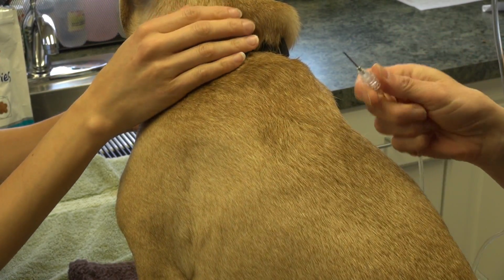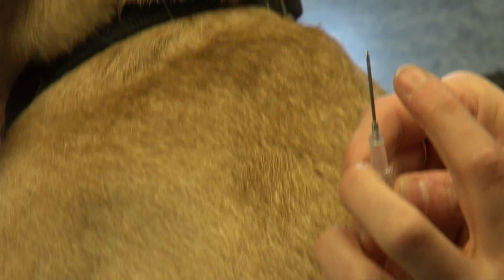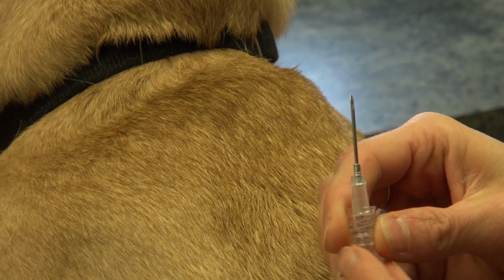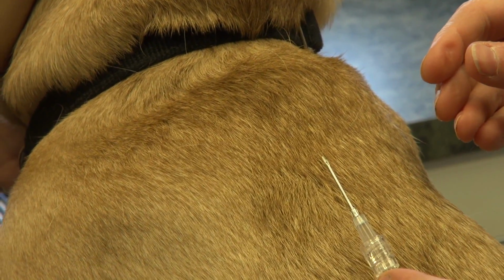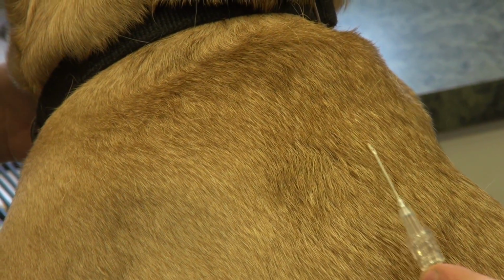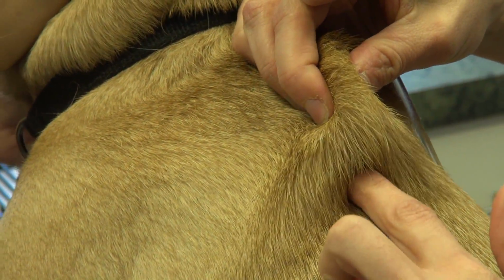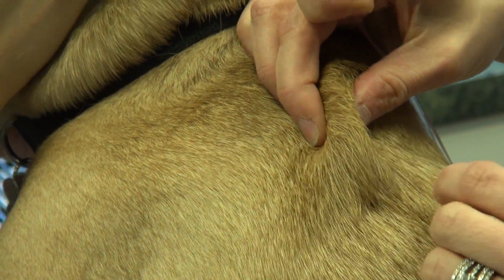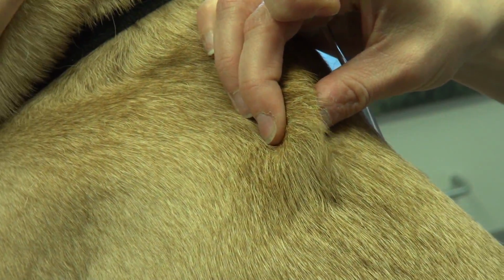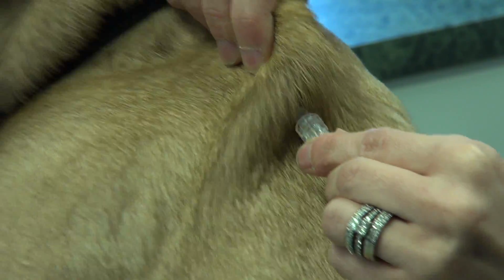So I'm gonna take it off, and then if you can see here, this is called the bevel, and we call it bevel up. You want the bevel to go in like this, under the skin, and then the fluids are gonna flow out there. So you tent the skin, you create a pocket right here, just like that, a little tent. And then you gotta make sure your clamps are undone. I'm gonna poke it under the skin here.